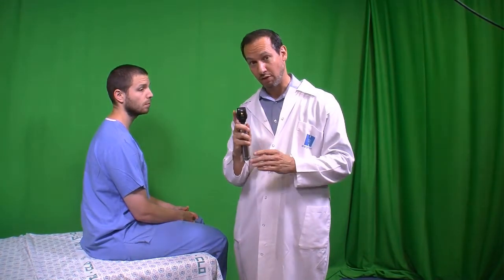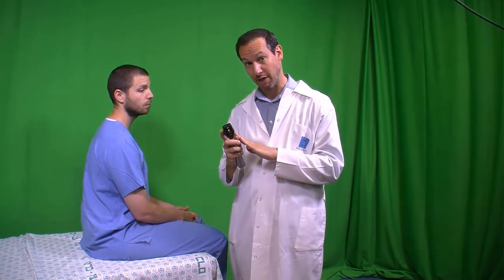Okay, at this point I've asked the patient's permission to examine him. I've washed my hands and I'm going to proceed now to examine the eyes. I'm holding with my right hand the direct ophthalmoscope because I'm going to examine his right eye. And everything goes together. If I'm examining his right eye, I hold it in my right hand, and I'm going to hold it to my right eye. If I proceed to examine his left eye, I'm going to switch hands, hold it to my left eye as well.